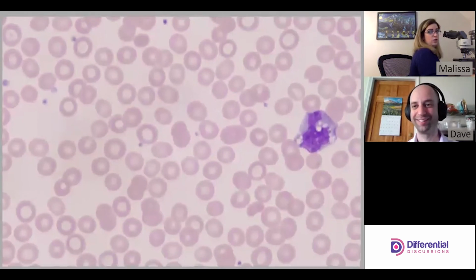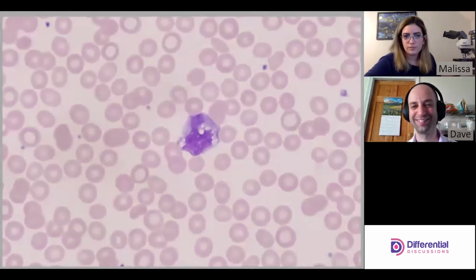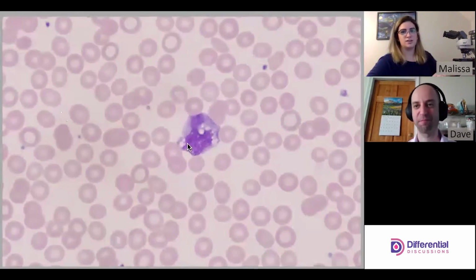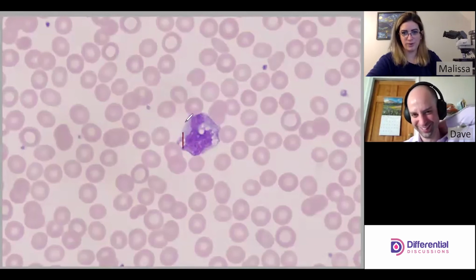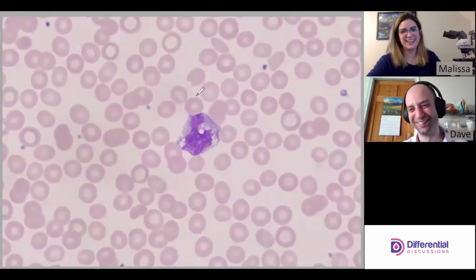Another gold. Another mono. Same features, and it's almost got the horseshoe shape again in this one. Not quite as nice, but it's like, I gotta get my little drawing guy back. Like this. Oh no, it says no. I keep drawing hearts, not horseshoes, but you heart hematology. I mean, what can we say?